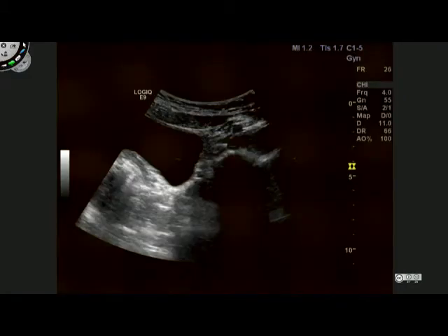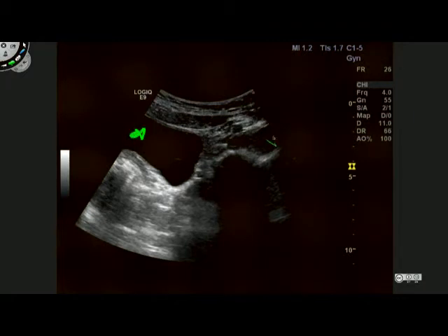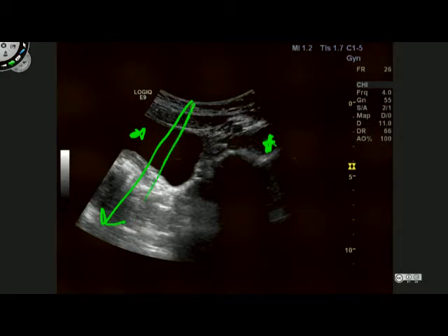Returning to the example of the urinary bladder, this is a transverse image. We have our urinary bladder here full of fluid and this is the left adnexa in this particular patient. As we can now appreciate, we know that our ultrasound beam will pass down here, pass all the way back to the transducer, and we have posterior enhancement here because of the high signal.